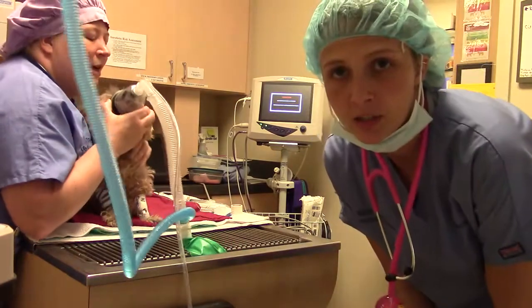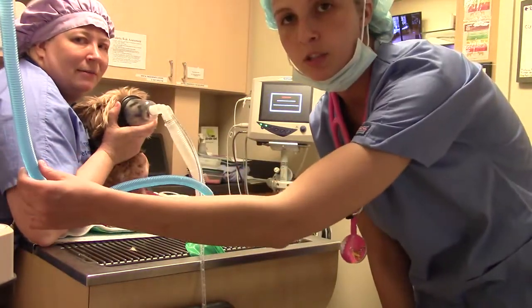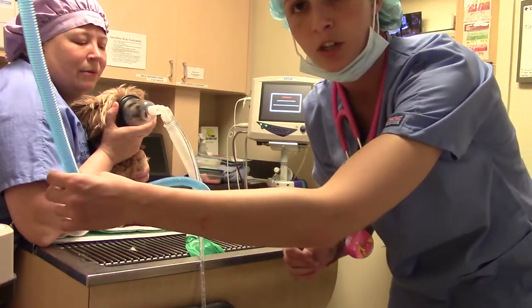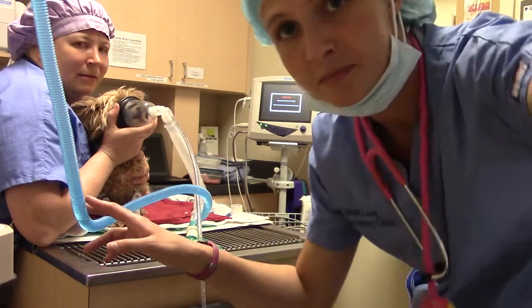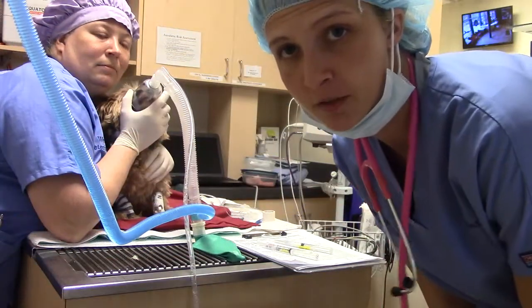We're about to induce for our dental assessment and treatment. Right now we're pre-oxygenating using a mask that fits her, and we'll pre-oxygenate for five to seven minutes. We've now pre-oxygenated for five to seven minutes, so we're going to go ahead and induce.